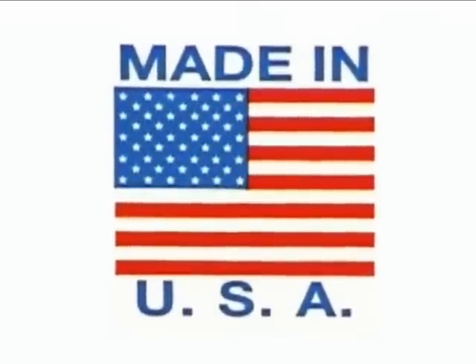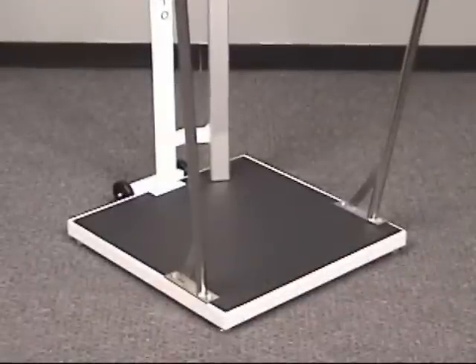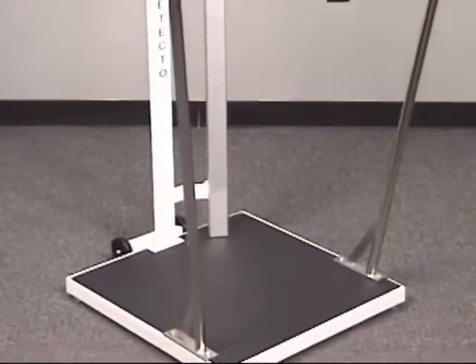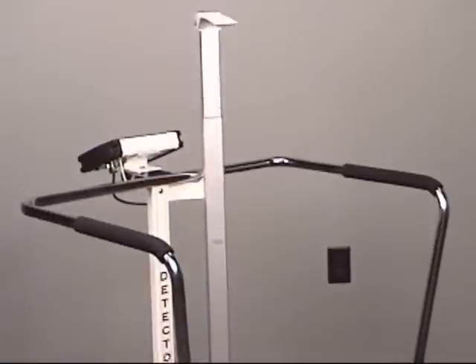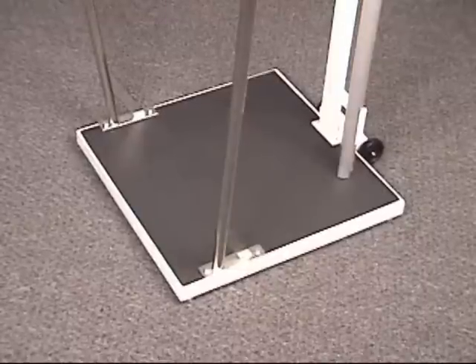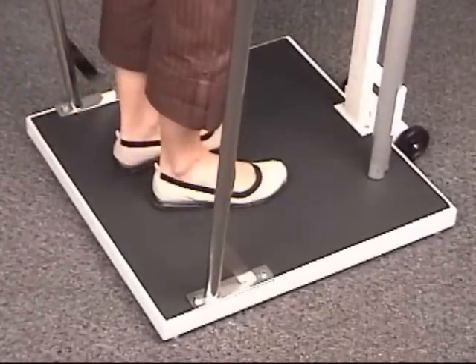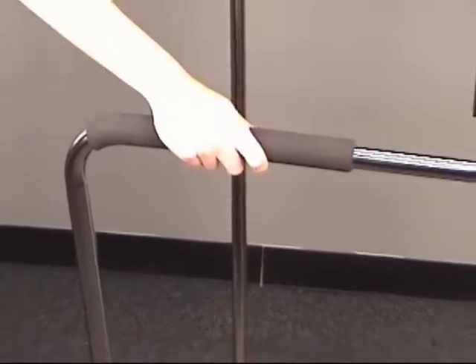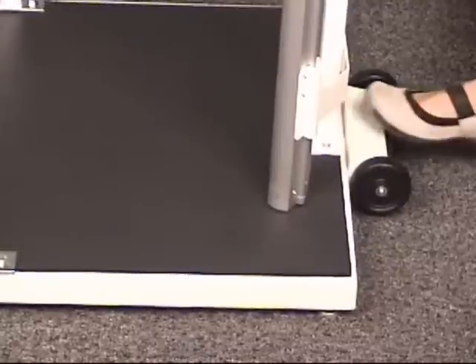Manufactured in the USA, you get the comfort of Detecto support for years to come. The 6857 DHR is the answer for bariatric needs and patients who require comfort and support during the weighing process. The 800-pound capacity scale base incorporates solid steel construction and is both low-profile and spacious to provide absolute ease of weighing for the patient. Detecto stainless steel handrails are designed to stabilize the patient during the weighing process, and the built-in wheels provide mobility to other rooms.